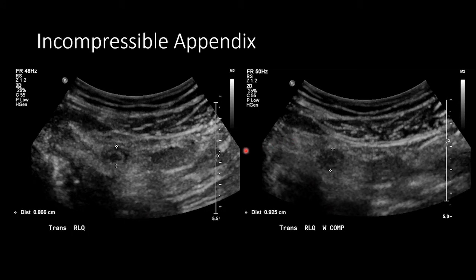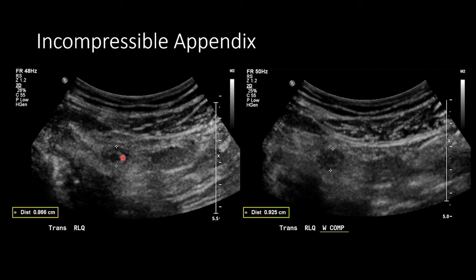Another key feature for diagnosing acute appendicitis — best and really only accomplished with ultrasound — is determining whether or not the appendix is compressible. Here I'm showing a short axis view of the appendix with both uncompressed and compressed images. The ultrasonographer applies firm then stronger compression to see if the appendix, which measured greater than 8 millimeters, will collapse with pressure. In this case, there is no significant change in the diameter when compressed versus non-compressed. Also note the large amount of echogenic fat surrounding the appendix, another sign of acute inflammation.